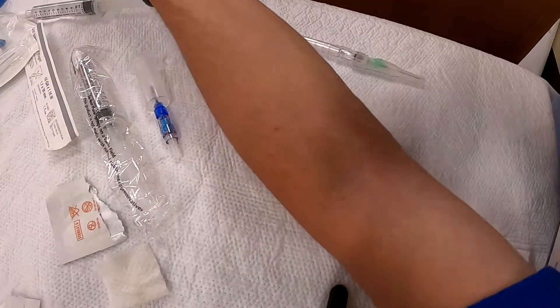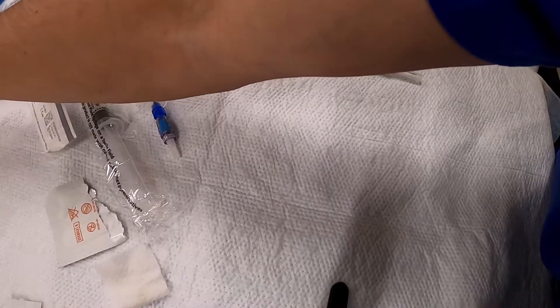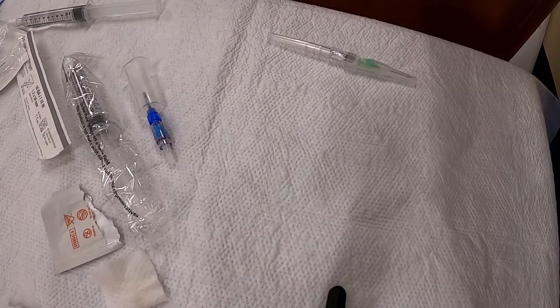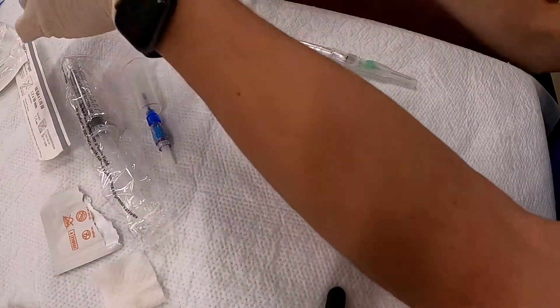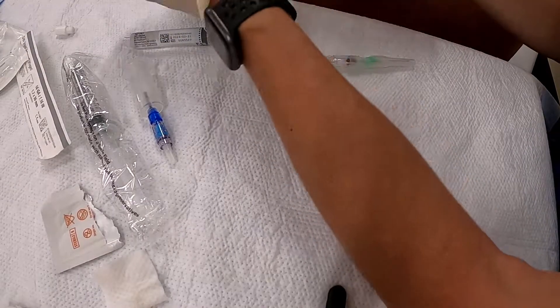I've got some tape somewhere — it's on your arm. It's funny that we set up in very similar ways and as you get used to it you're like, hey, where'd my tape go before you get it started.